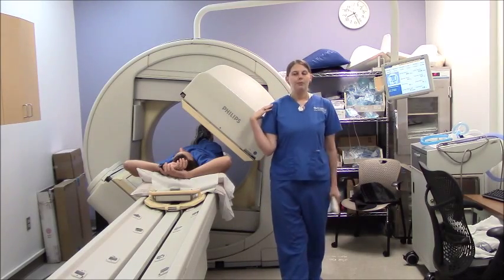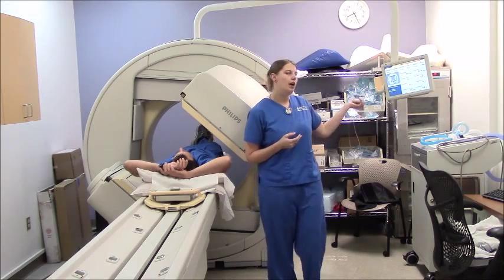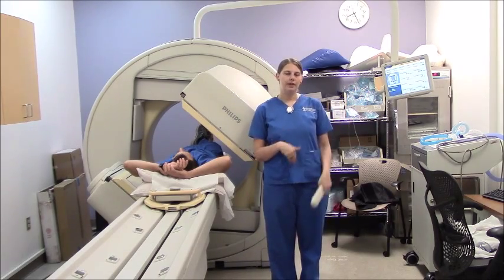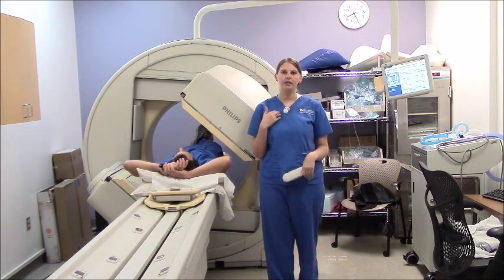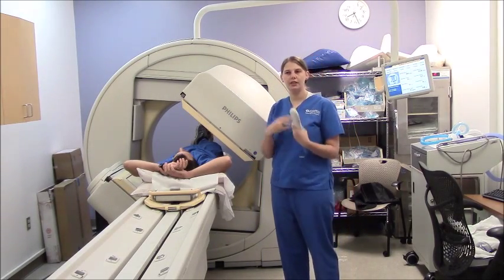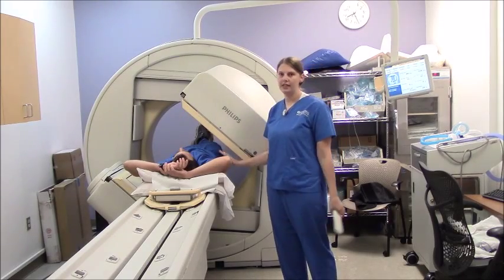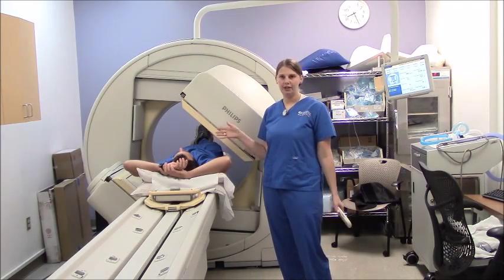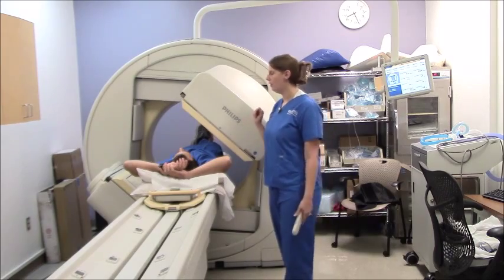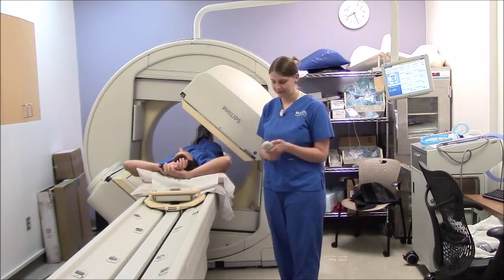For these angle pictures, you can start at a 45-degree angle, but you will want to check your screen to make sure you have a nice separation between your right and left lung. Once you get a good angle that shows the lungs in a good oblique view, then you can bring the heads in again and begin your picture. I'm going to skip that and just show you the next view we would take.